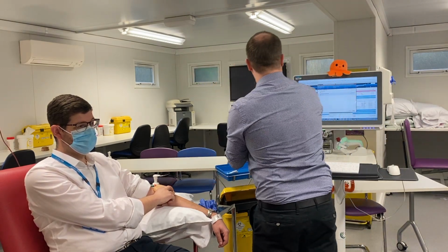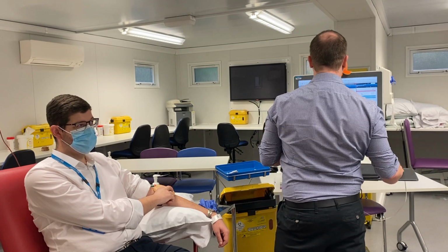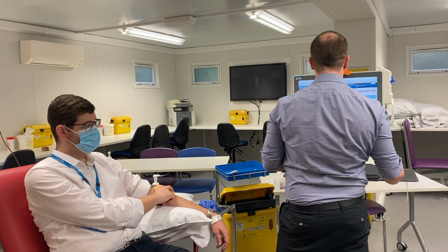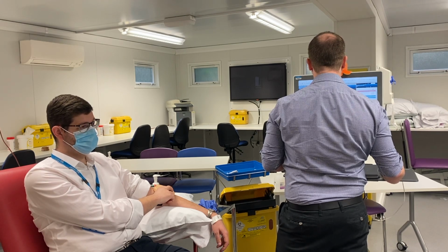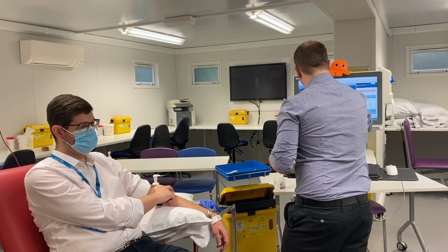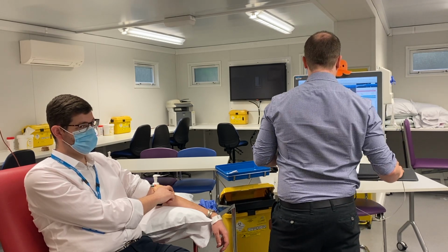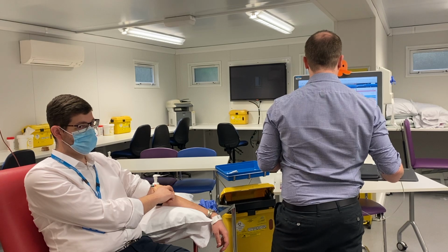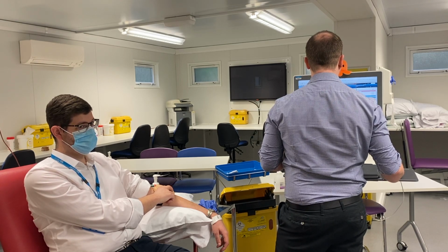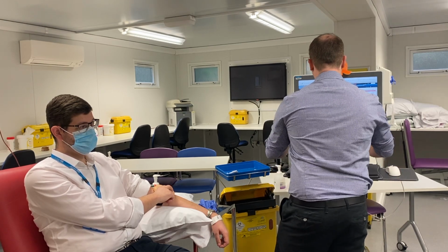I'm going to give my hands another clean, and I am going to say on this computer that I need to print out my labels. So print all labels. I'm going to select the printer that I want to use, and then I'm going to press print. And my labels will print out. I'm then going to say that I collected each bottle that I've collected, and sign to say I've collected them.